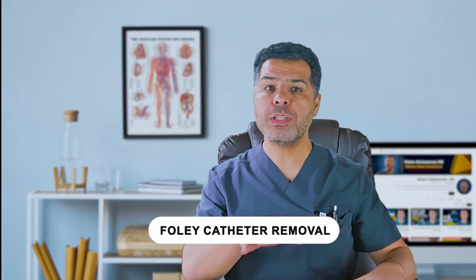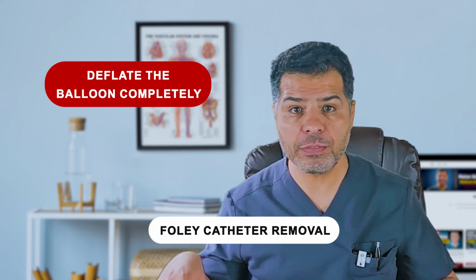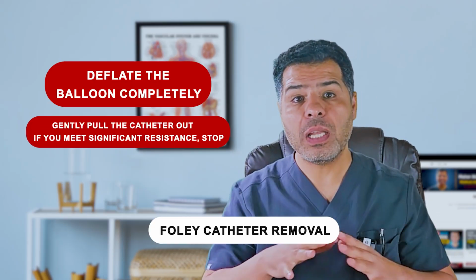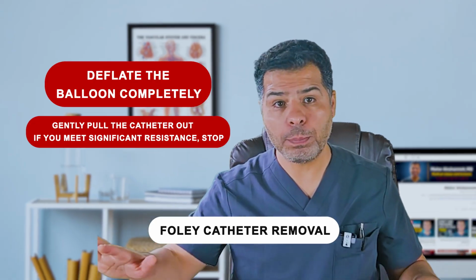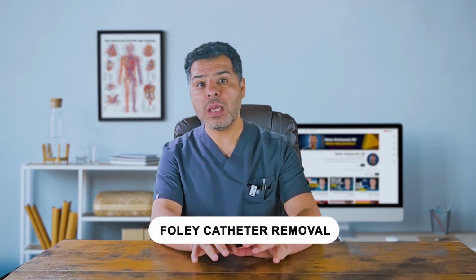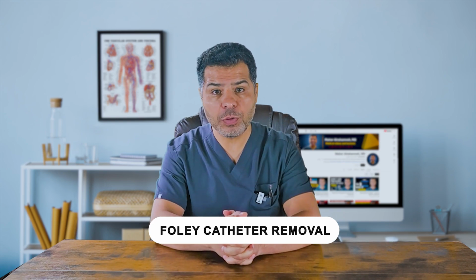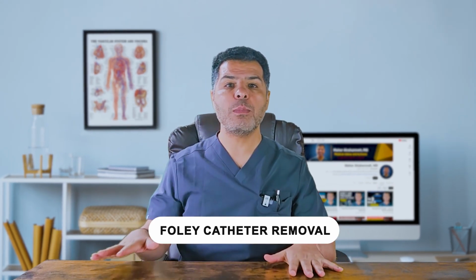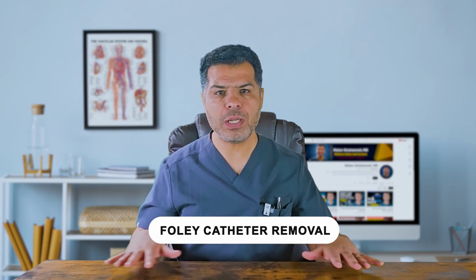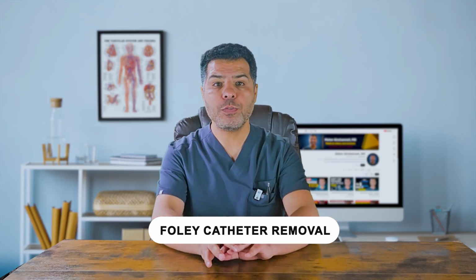Now, how to remove? We deflate the balloon completely first by withdrawing all the water from the inflation port using a syringe, and gently pull the catheter out. And if you meet significant resistance, stop, please. The balloon might not be fully deflated or there might be incrustations. Never force the balloon removal if you face resistance. And document the time of removal and instruct the patient to try to void within the next 6 to 8 hours. Monitor for post-void residuals, PVR, if there are concerns for retention.